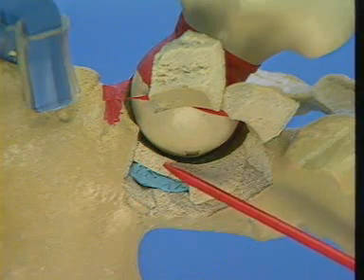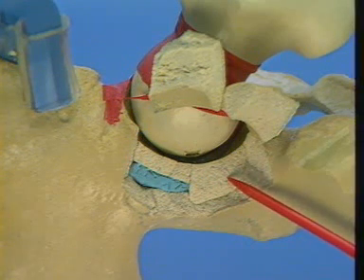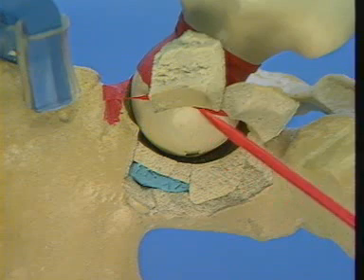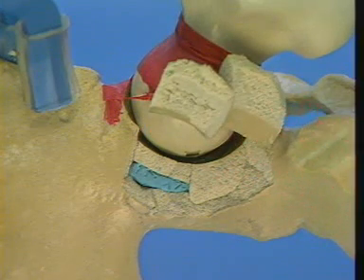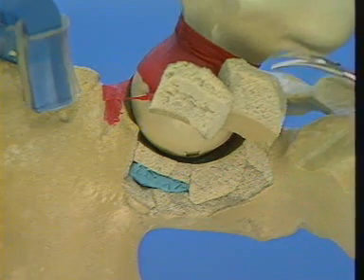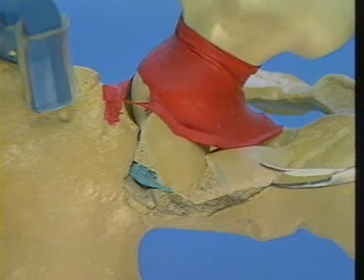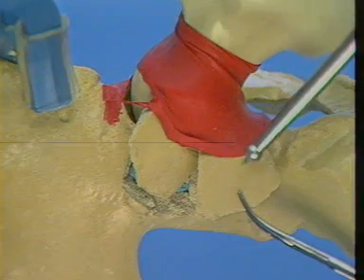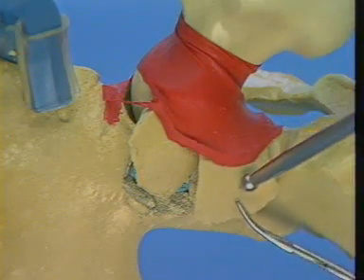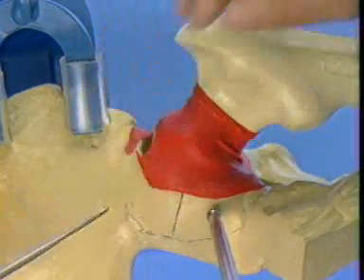These two fragments of bone that have been repositioned will not be directly internally fixed. They will, however, be held in place by the overlying segments of the posterior wall and the implant applied to the overlying segments. The fragments of the posterior wall, which comprise a part of the retroacetabular surface, are now reduced into place. It's usually necessary to reduce both fragments simultaneously with one's finger and also with the help of the ball spike. A periosteal elevator can also be used.